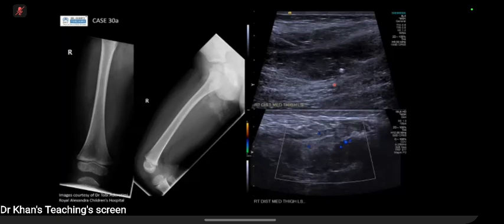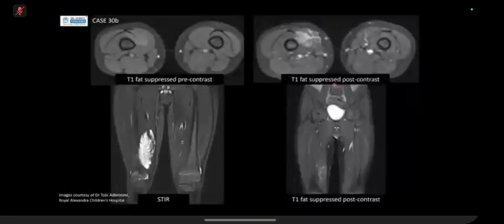And if it's a more lymphatic one, then these would often swell when the patient is unwell. Okay, so the venous one is a bit more dependent on activity. But the lymphatic ones often swell when there's a change in your lymphatic system, so like when you're unwell, a general rule. Then going on to MR. Some clinicians, if they wanted to operate on it, because it's very extensive, will ask you to do an MR.